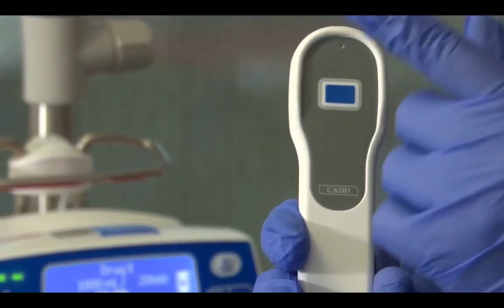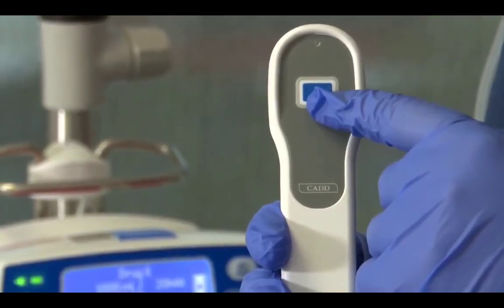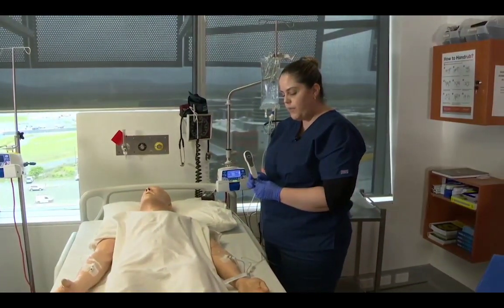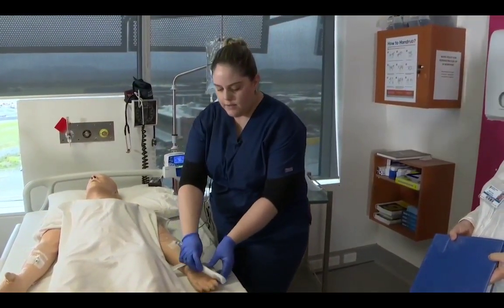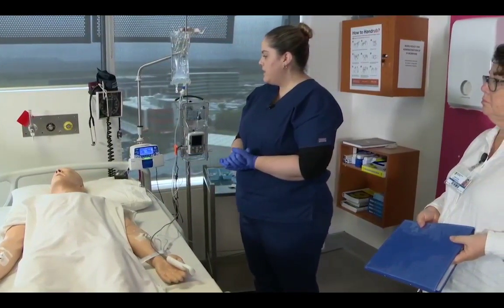So if it's within that 5-minute window, even though you push the button, the medication won't go in. But if it's outside of that, you push this, then it's going to give you a little volume of the medication, which is going to help with your pain management. So I'm going to hand you that now. Patient's got that. And if you have any questions in the meantime, just buzz the buzzer and we'll come running.